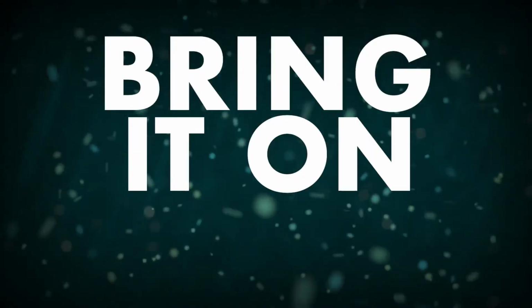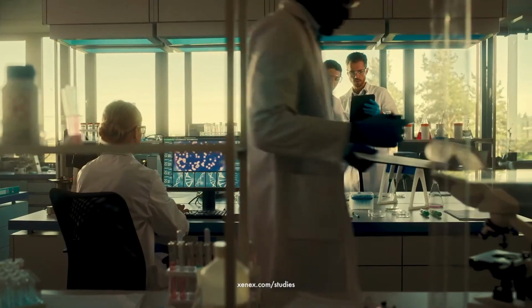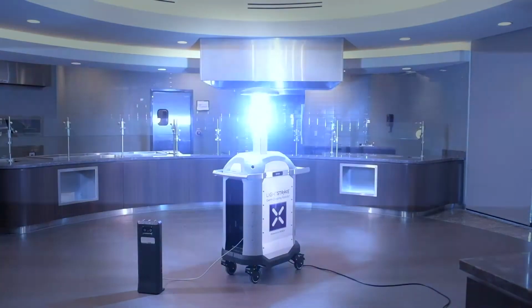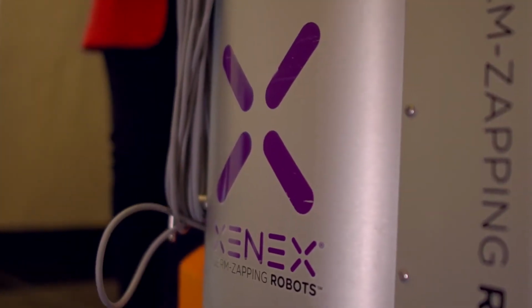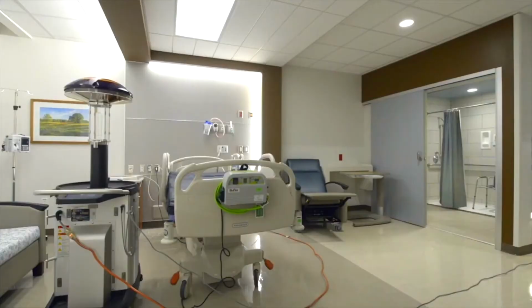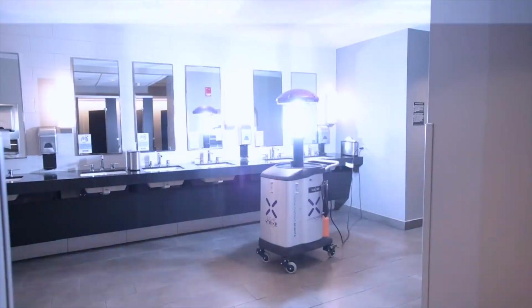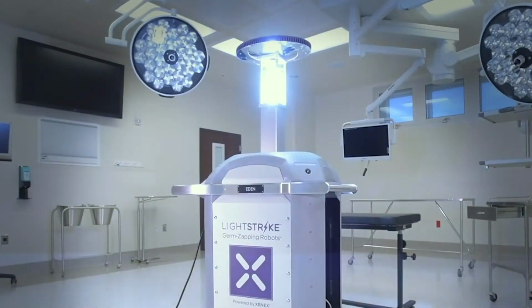A robotic disinfectant called Xenex drives autonomously to patient rooms as they are being discharged and then bombards the vacant space with pulsed, full-spectrum UV rays, killing a variety of infectious germs in a matter of minutes. It's designed to reduce HAIs, such as methicillin-resistant Staphylococcus aureus, by killing the microorganisms that cause them, which can be particularly resistant to treatment. Additionally, the robot is kind of adorable.